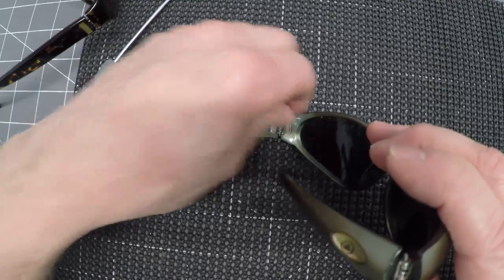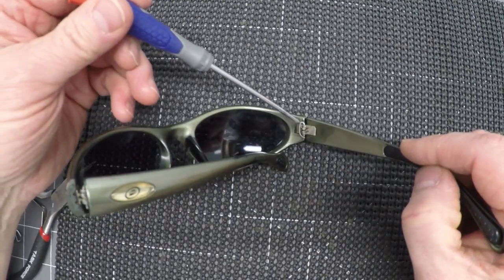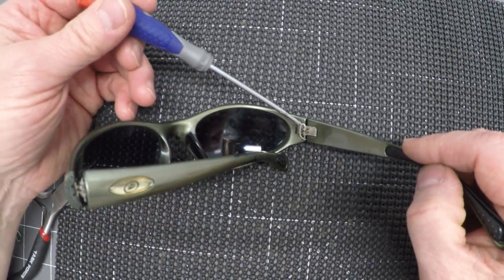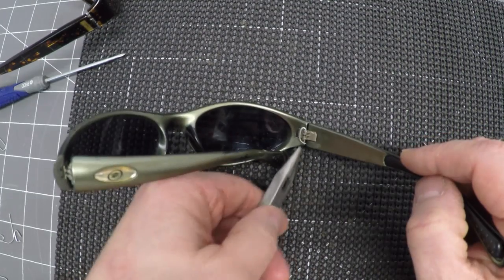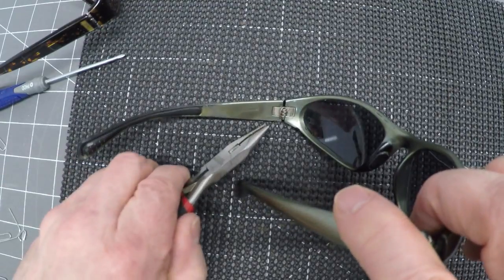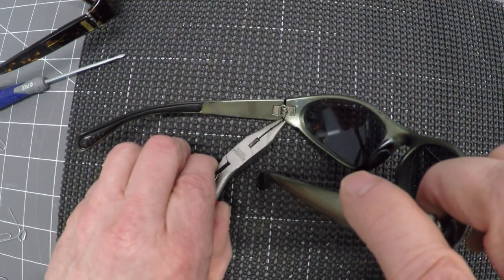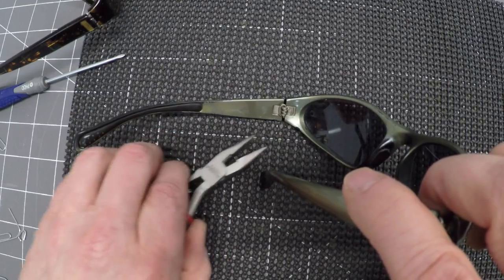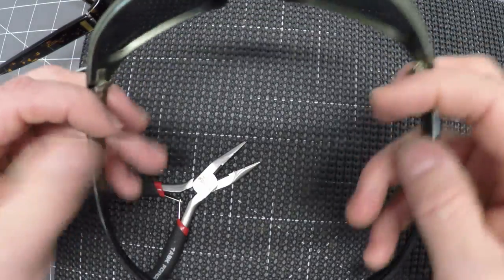Here's a pair I had this on for years. Initially, when I broke this one, I was on the road, and found a paperclip, just asked somebody in a store, and I actually had a small pair of pliers and I cut it off. When I lost this screw about 6 months later, I was in my office. All I had was a pair of scissors. So I put the paperclip in there, bent it over, and then I actually marked it with this little pair of scissors and then worked it back and forth and broke it off. But you can see, works perfectly.